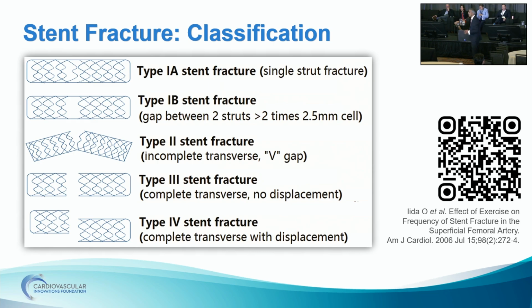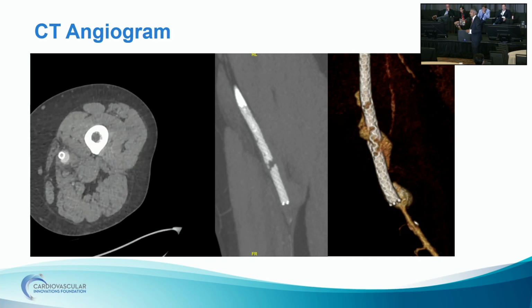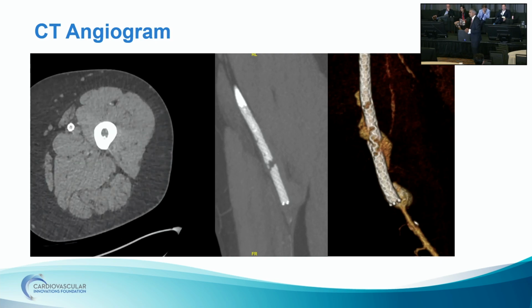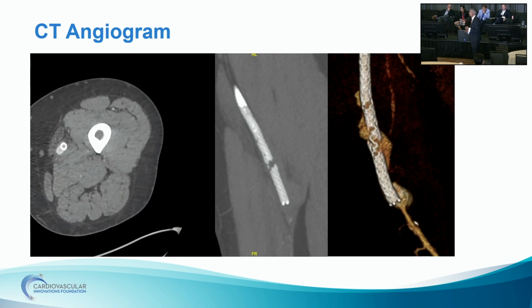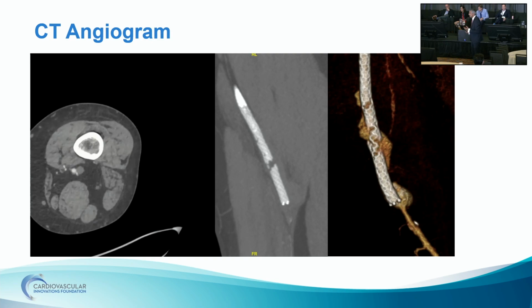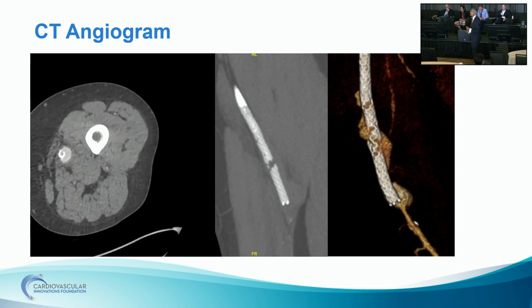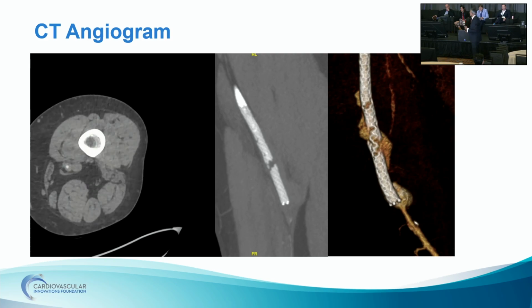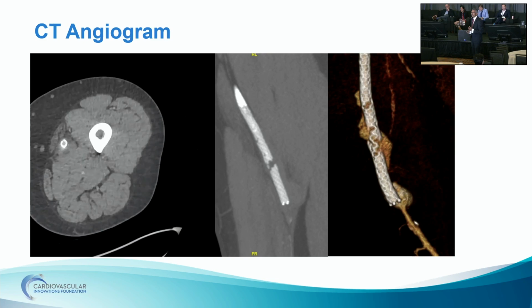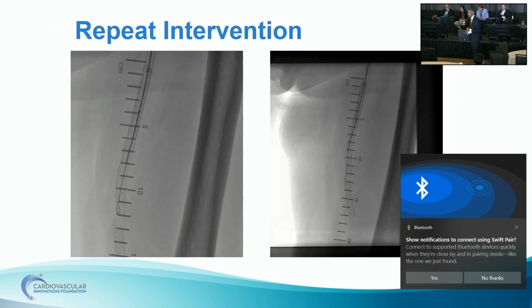I hope you agree. And this is the CT angiogram to show the corresponding nature of the disruption of the architecture of the stent that intimately relates to the formation of the pseudoaneurysm. I'll let you scroll through this for a few moments. This case has started a finding of stent fractures and other mechanical complications of stents in the lower extremities within our registry. I want to highlight this as we go forward.